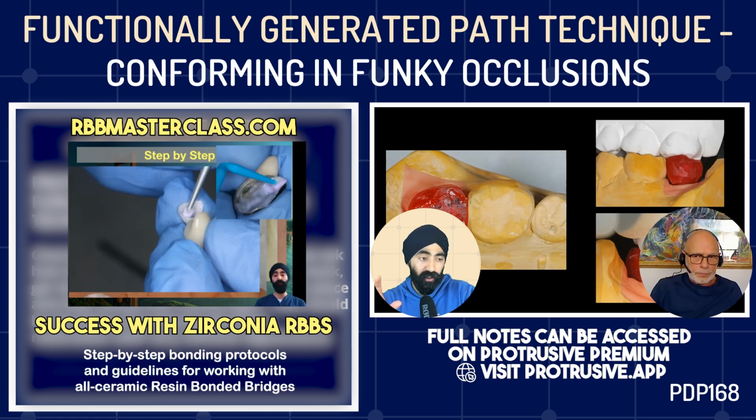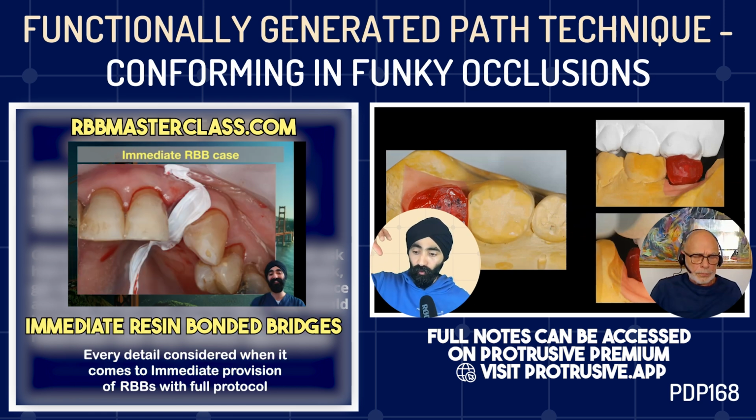Now, just some nuances of the actual technique. Acrylic gets hot as it sets. It never gets so hot that you need to remove it, or practice with acrylic when I make a temporary crown out of acrylic to get the path of insertion so it doesn't lock in, insert, remove. Is that necessary? And also, has the temperature ever been a problem on a single unit for a patient?